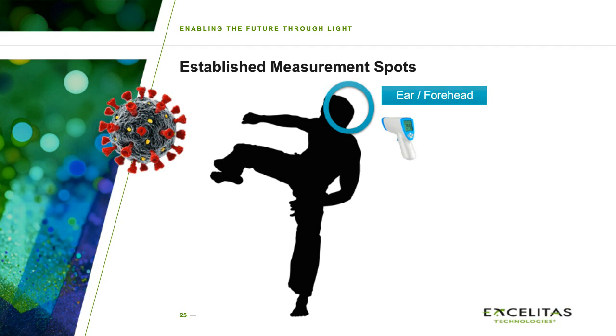So we are operating at the sweet spot where you can produce devices which you can actually supply to the market below, let's say, $100. And this is our target for the market: high volume applications which are just good enough to help you identify those people, and then you have to remeasure.